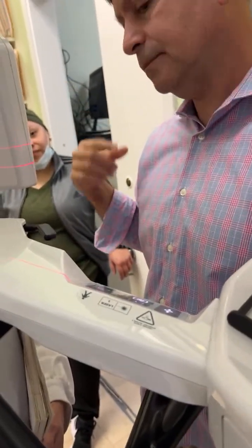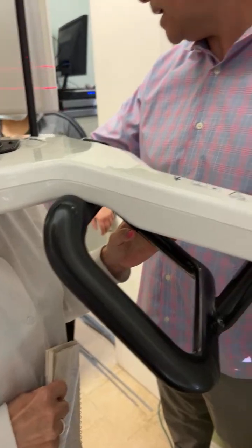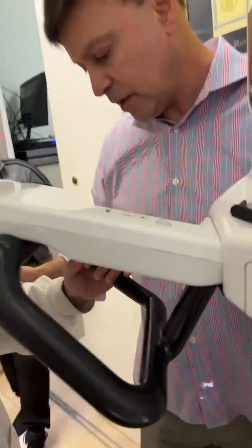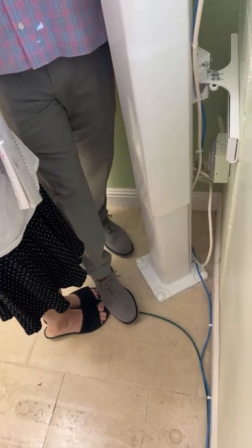So your hands would, of course, come up here. You would remove all your jewelry, any metal. Put on a flat apron without a thyroid collar, no thyroid. Hands there, and you walk forward until you touch my foot, which is roughly 10 or 12 inches away from the column. So you're right under the machine. It feels a little awkward.